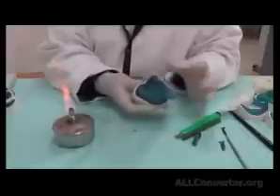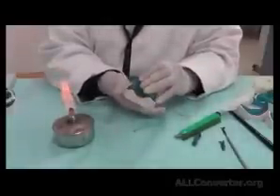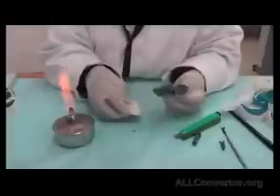Okay. So now I have recorded the posterior part, and I've also asked the patient to say ah while I'm doing this step, and you can see that it took a copy of what we have on the cast.